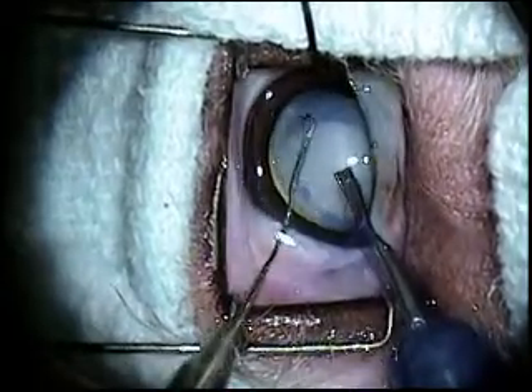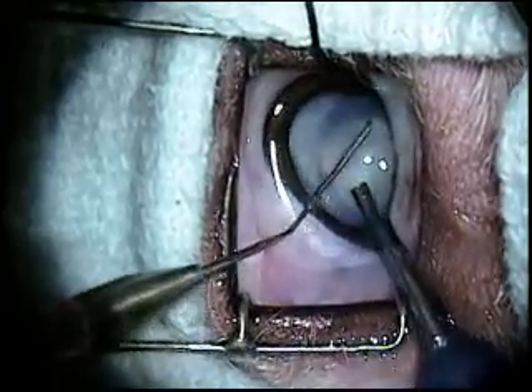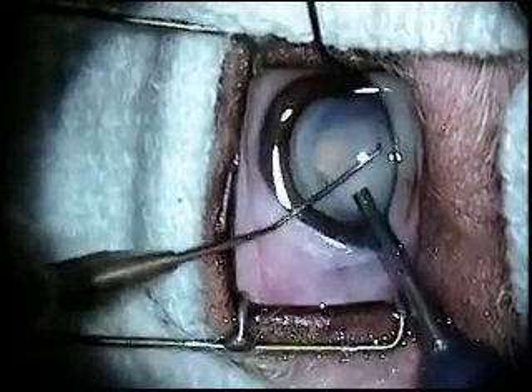Two instruments are introduced into the eye to allow for manipulation of the lens during the ultrasonic emulsification of the lens.